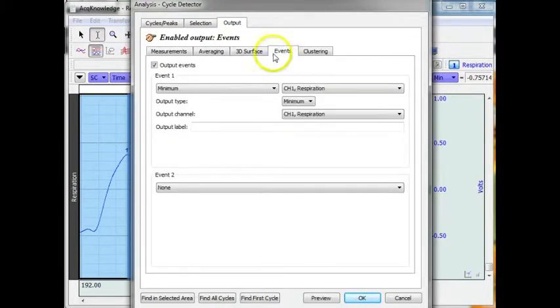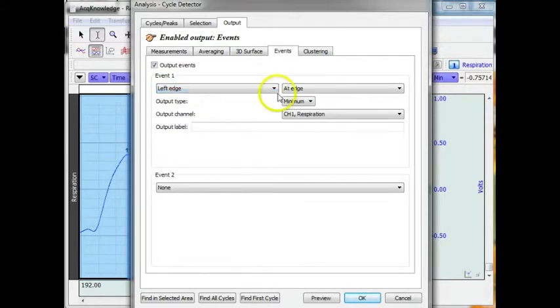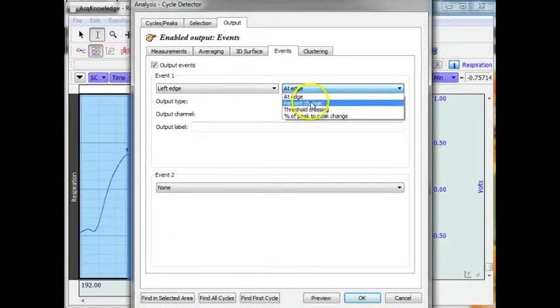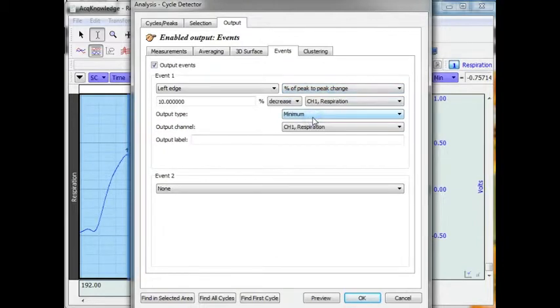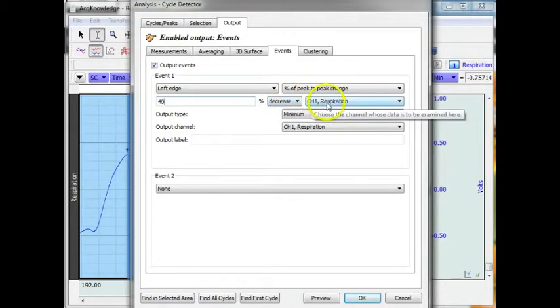I am going to go back into events. I am going to look at the left edge. And I am going to look for a percentage of peak to peak change. And I will use 40% decrease.